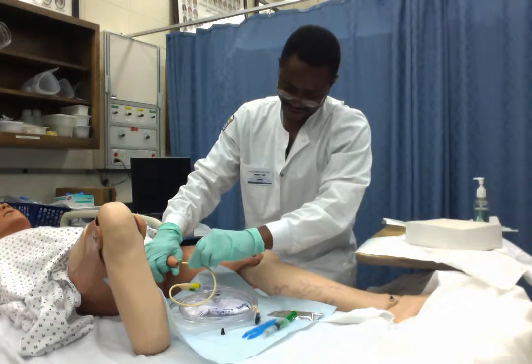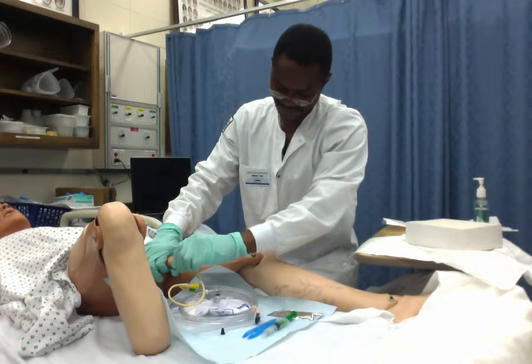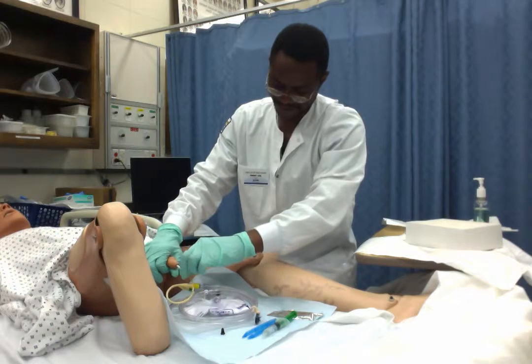I will gently insert the catheter into the urethra of the penis.